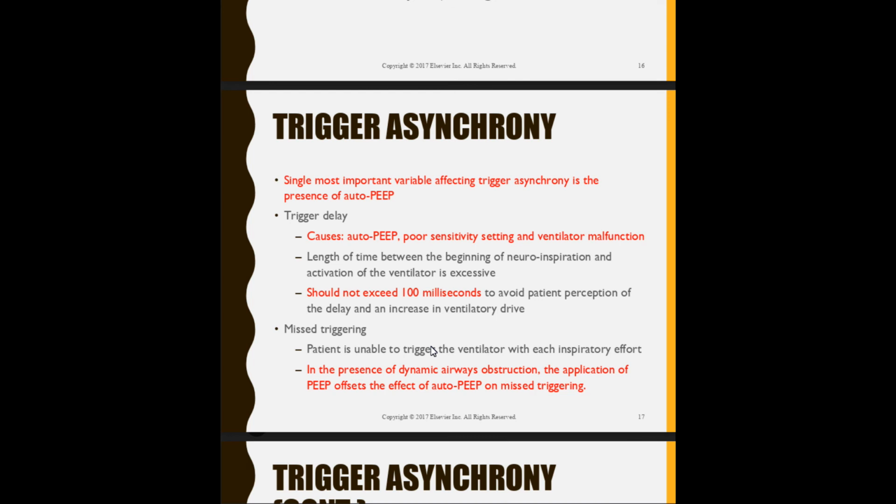Now think about dynamic compliance. Think about dynamic airways. When you think about dynamic compliance, you're dealing with the peak inspiratory pressure and the PEEP, the baseline. When we talk about peak inspiratory pressure, you're talking about upper airways. When you're talking about PEEP, you're talking about pressure in the alveoli.